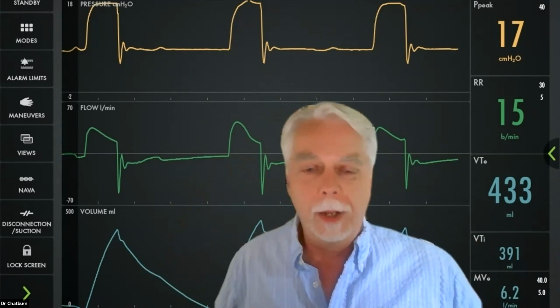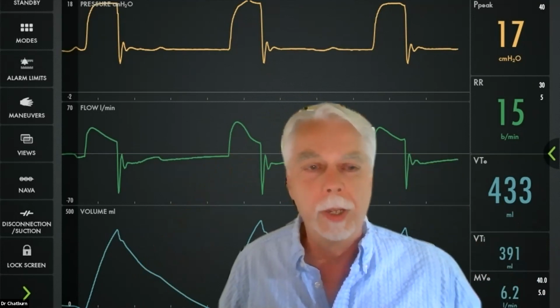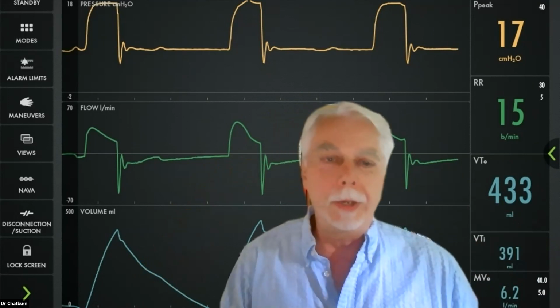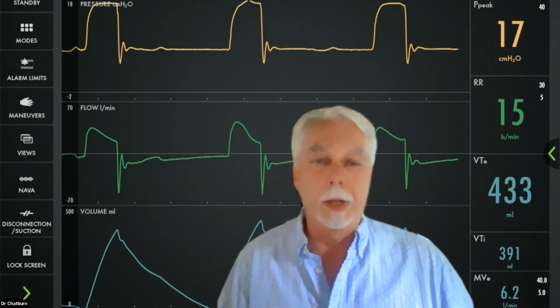But yeah, we have to find ways to improve synchrony. And it's never going to be perfect if for no other reason than there is some momentum, right? A volume of gas has physical momentum. It takes time to accelerate that into the lungs.